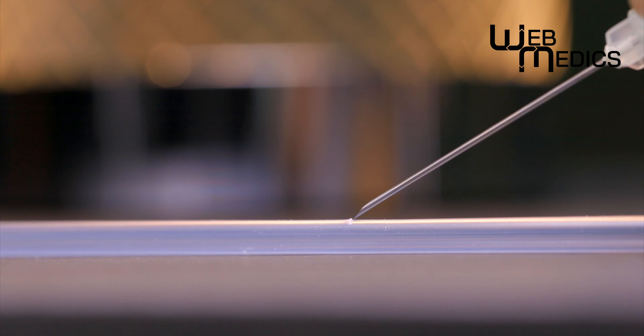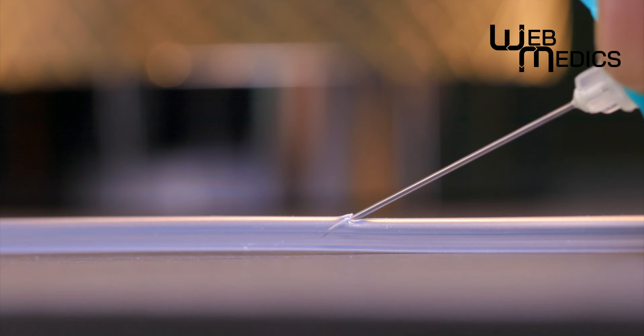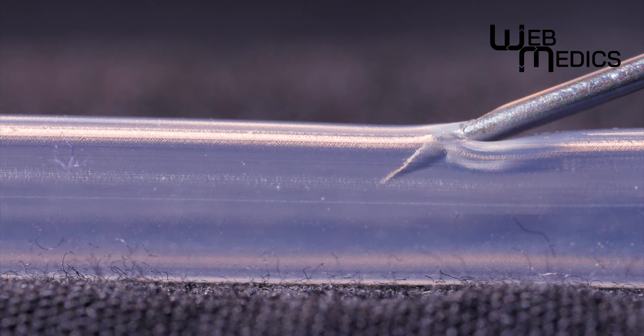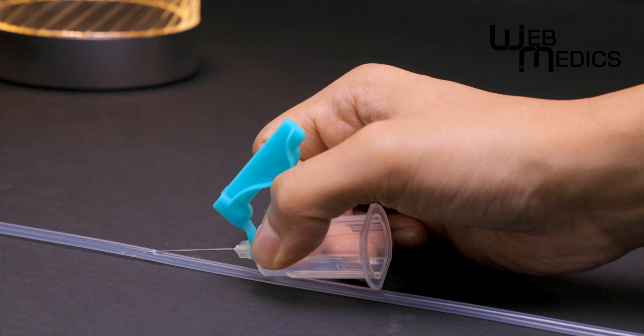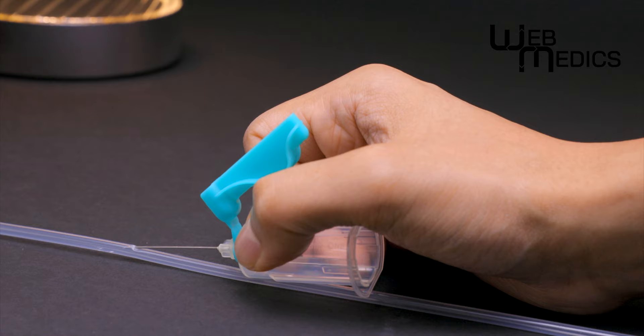As for maneuver, we need to advance two millimeters or a sixteenth of an inch after flashback. This ensures we are fully in the vein. Then we can flatten the angle and advance further. Finally, we should anchor the needle in its final position as we withdraw our syringe plunger or connect our bottles.